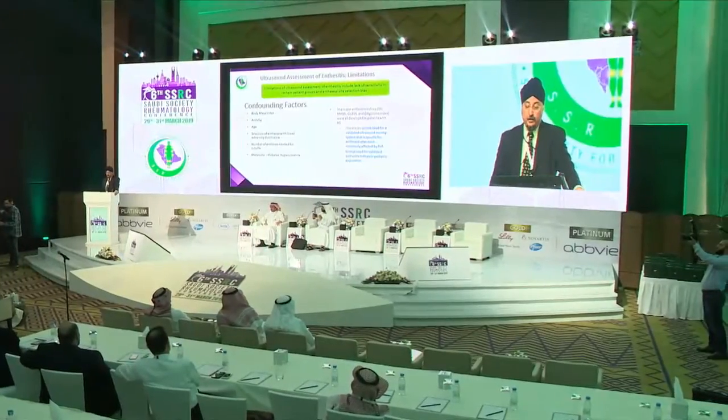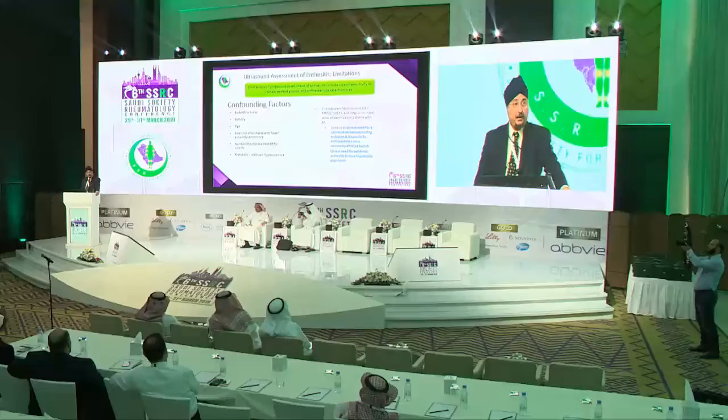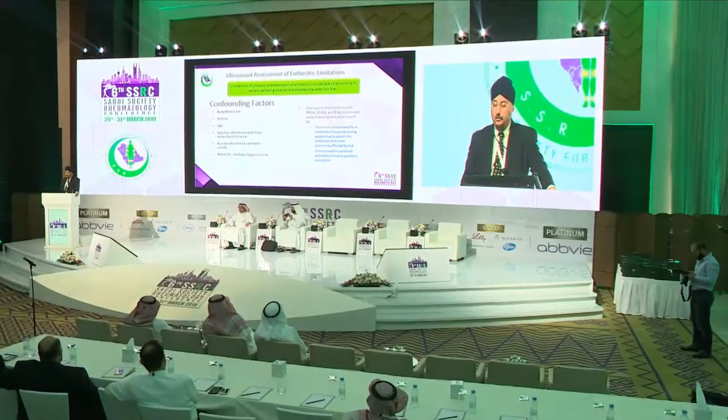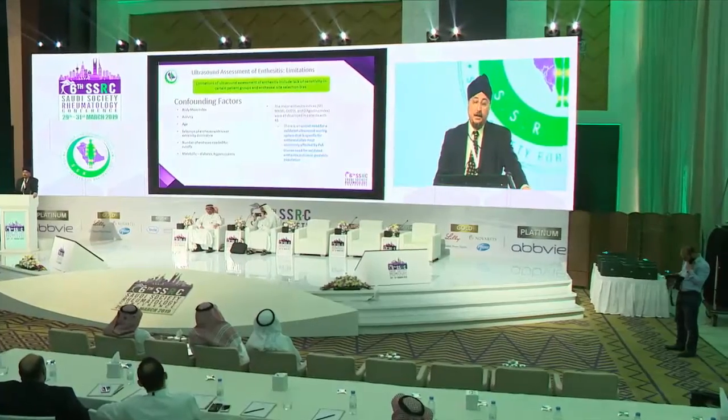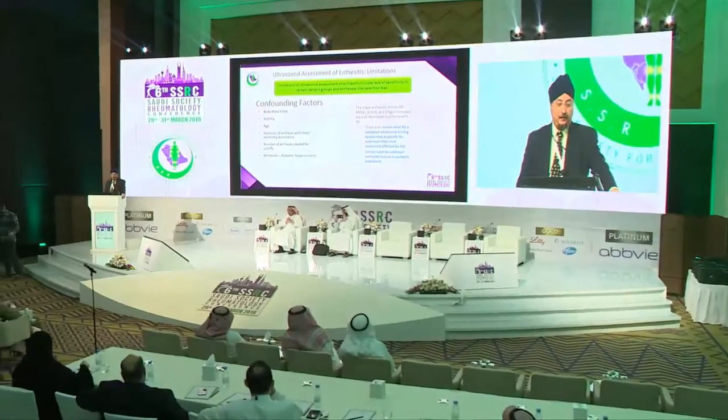biomechanical factors. The other problem is that a lot of these studies differ in the number of entheses they use and the cutoffs. And we don't want to forget diabetes and hyperuricemia, which are also common in this group of patients. Therefore, there's really an unmet need in trying to figure out how to fine-tune our ultrasound instruments to account for these confounding factors. So in the last few minutes, I'm going to go over some of the approaches different groups have taken in controlling for these confounding factors.